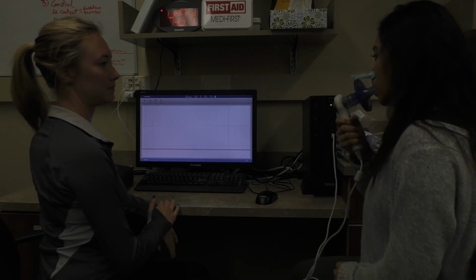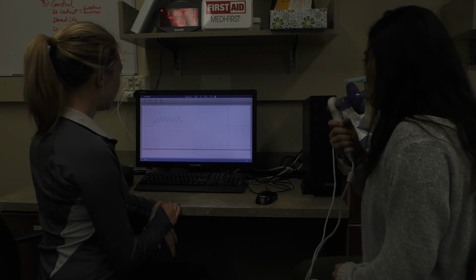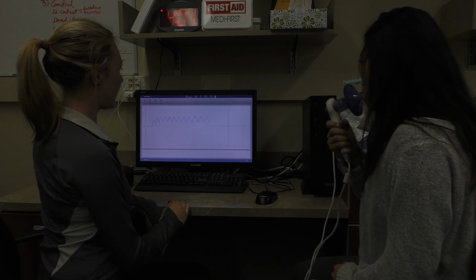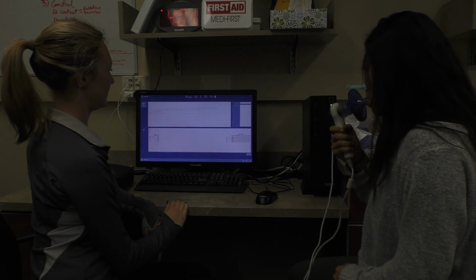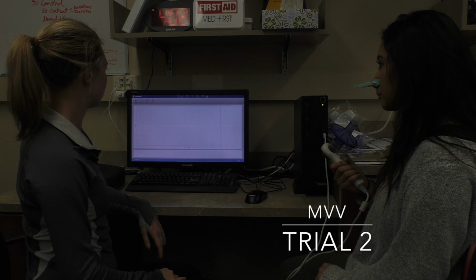Go. Good. Keep going. Good. Really some deep, strong breaths. Good. Keep going. A little faster. There you go. Good job. All the way to 12 seconds. Good. This will be MVV trial 2.